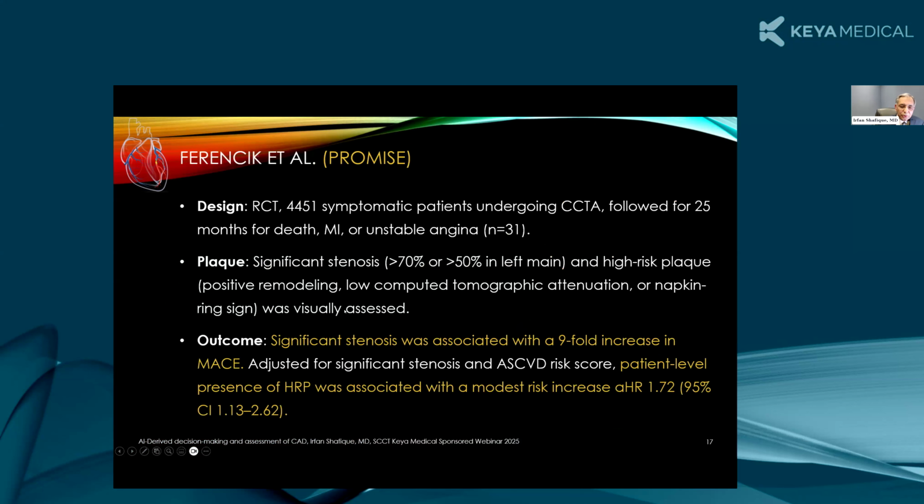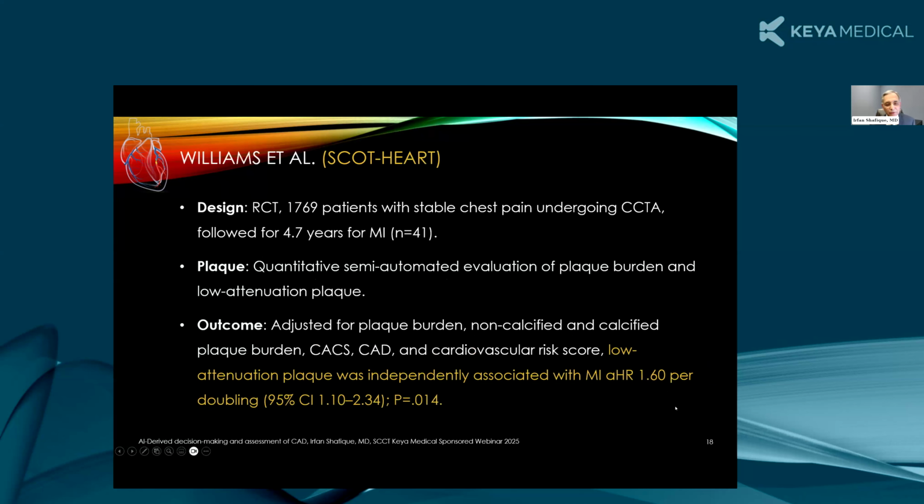Now, the PROMISE study has also shown that significant stenosis was associated with a 9-fold increase in MACE, but if you adjust for stenosis and the cardiovascular risk, then you can see the plaque shows the presence of high-risk plaque was associated with a modest increase in adjusted hazard ratio. That means high risk of coronary adverse events.